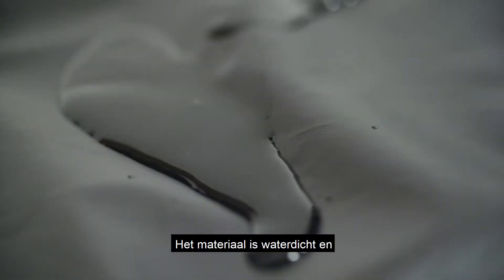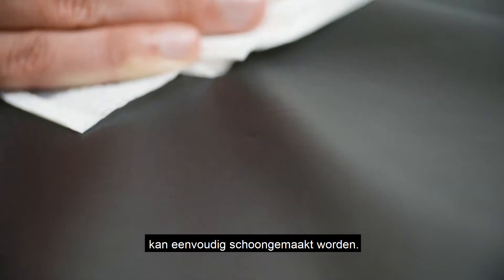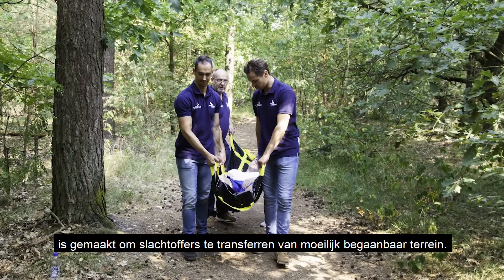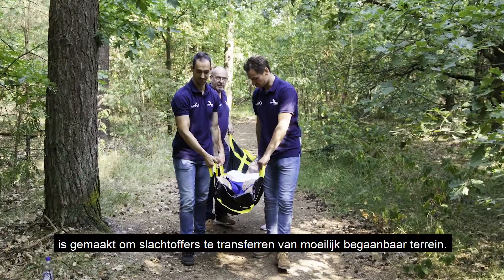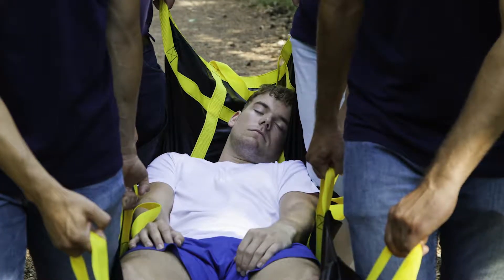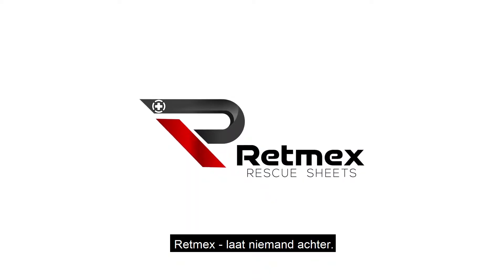For hygiene reasons, the fabric is water-resistant and can be easily wiped off. The RETMEX Rescue Sheet is designed to transfer victims from rough terrain. It's also suitable for transferring patients on and off stretchers. RETMEX leaves no one behind.